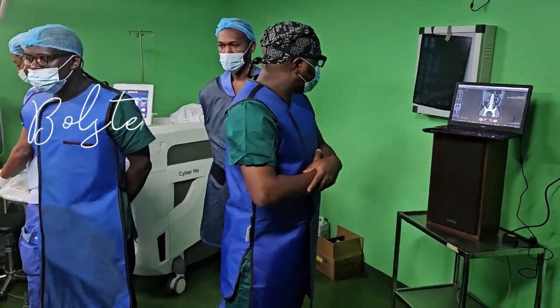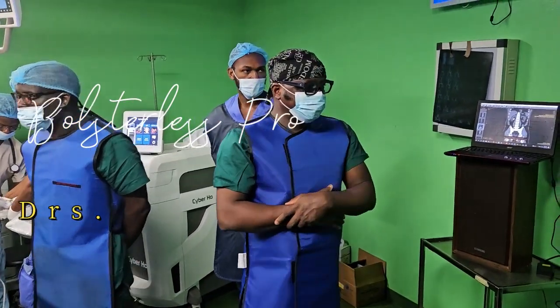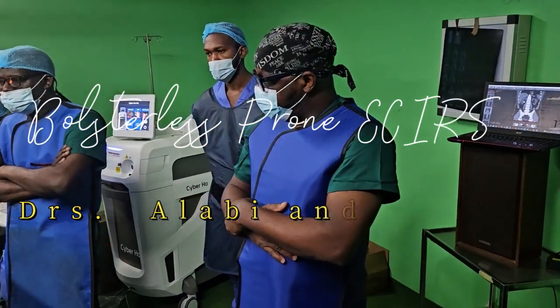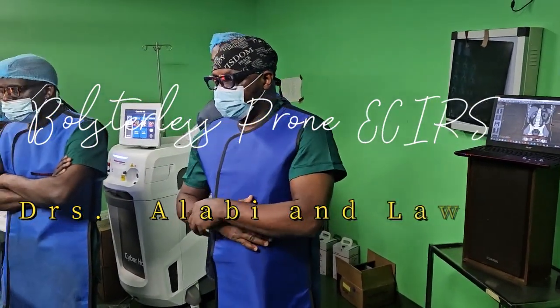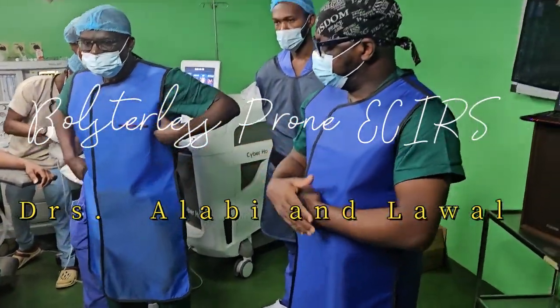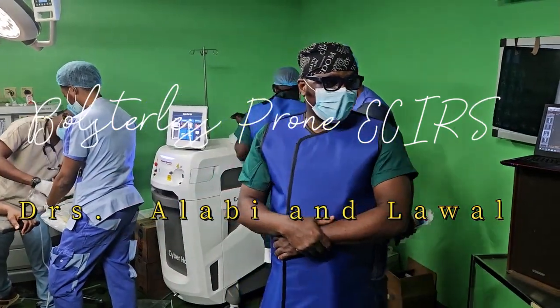The patient has a renal pelvic stone with a fairly dilated pelvicalyceal system. So I'm going to run us through the entire procedure, what we're going to do stage by stage before we start. You can see the patient is positioned.